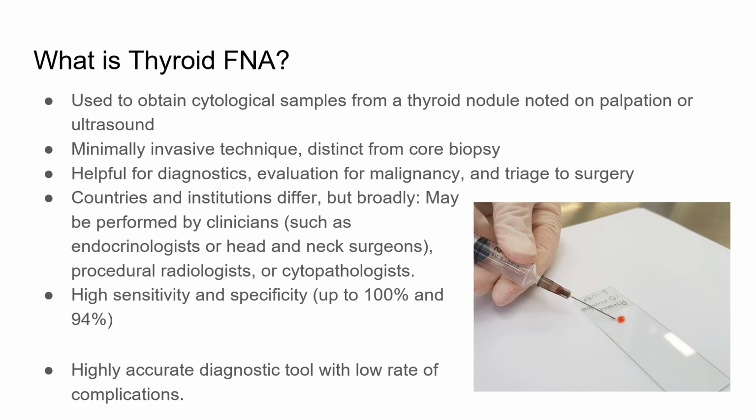With fine needle aspiration, the benefit is that it's a minimally invasive technique, which is also distinct from core needle biopsy. They both are kind of the same when you watch them, but the primary difference is core needle biopsy generates a much bigger hole, and anytime you do that, you do increase the likelihood of damaging structures around the targeted tissue, not to mention increasing infection risk as well. This technique is helpful for diagnostics, evaluation for malignancy, as well as triage to surgery.